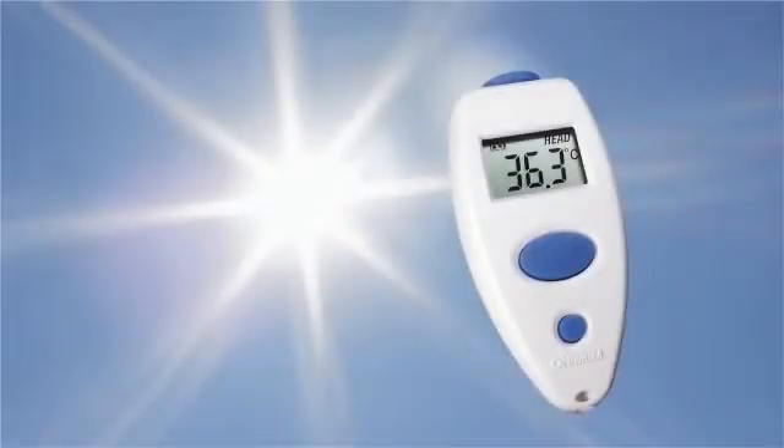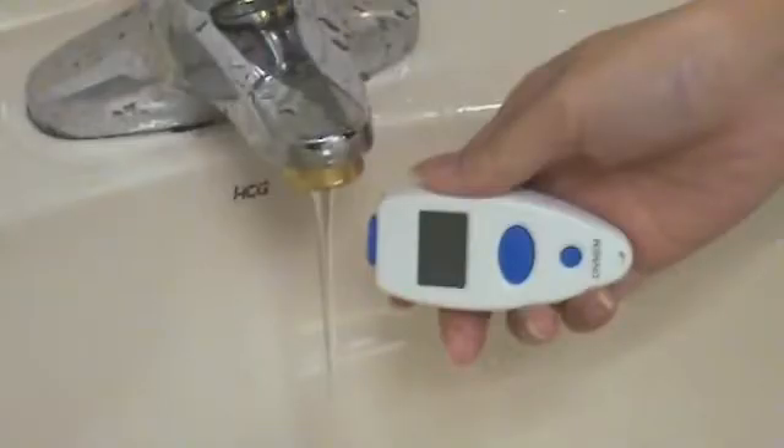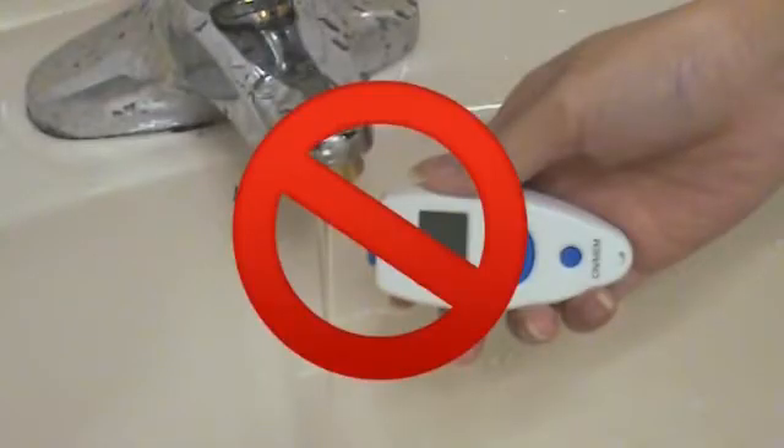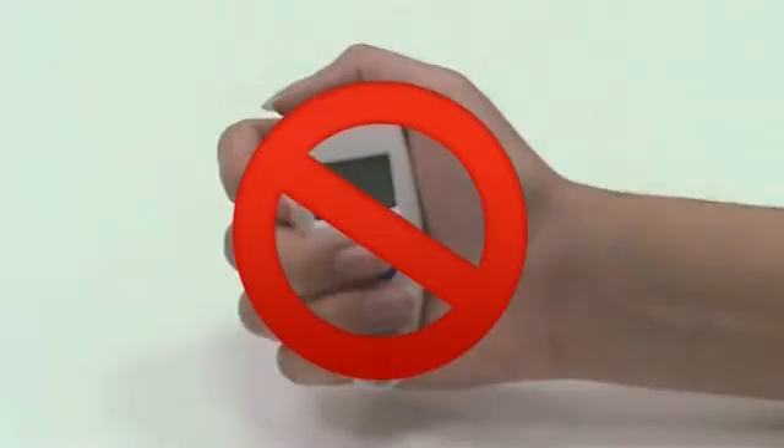Keep the unit dry and away from direct sunlight. Do not submerge the thermometer into any liquid. Holding the thermometer too long may cause a higher ambient temperature reading of the probe, which could make the measurement lower than usual.